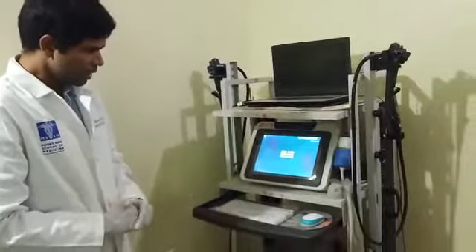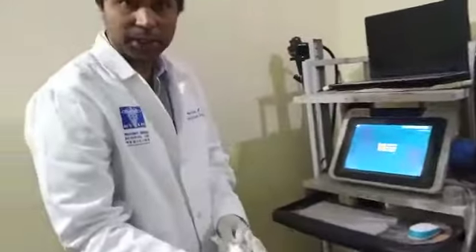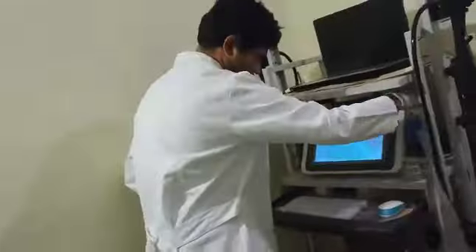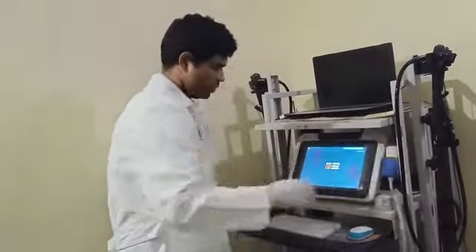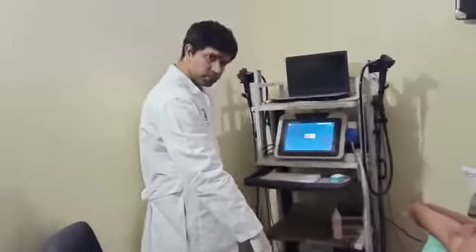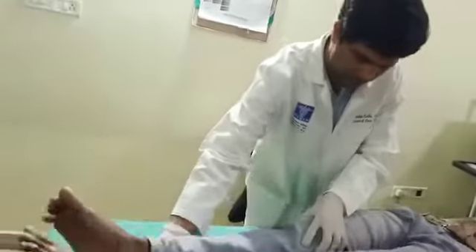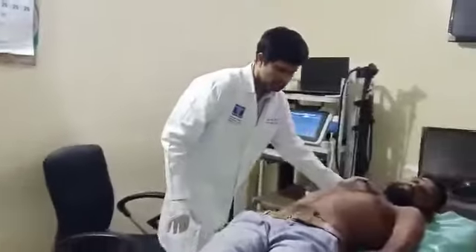Once you log in, the machine has a probe — pretty much like an ultrasound probe. There are no pins, no needles, and it doesn't really hurt. It has a foot switch which helps us record much more easily. You make the patient lie down flat, and then adjust their position with feet slightly apart.